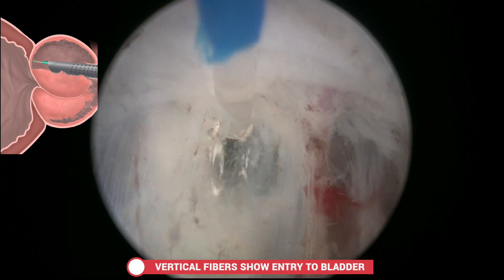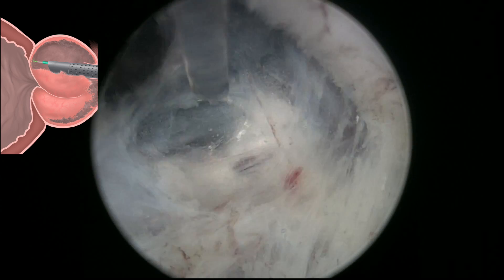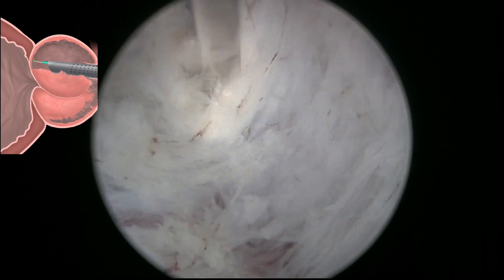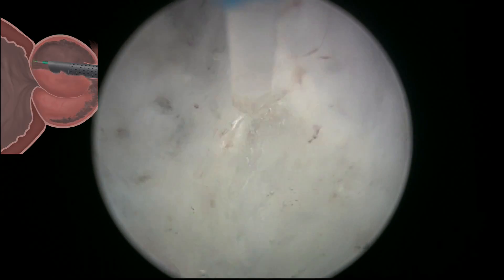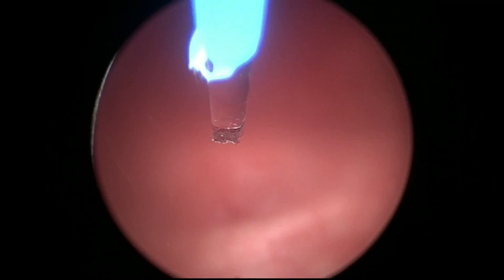When the 12 o'clock vertical fibres are found, this is a pathognomonic sign that this is the entry point to the bladder. Then the bladder neck is dissected following the direction of the fibres, with lines always deepened and developed.